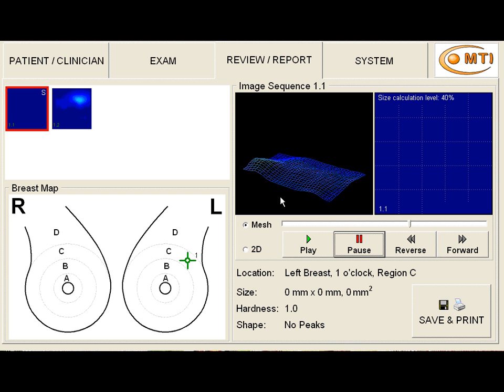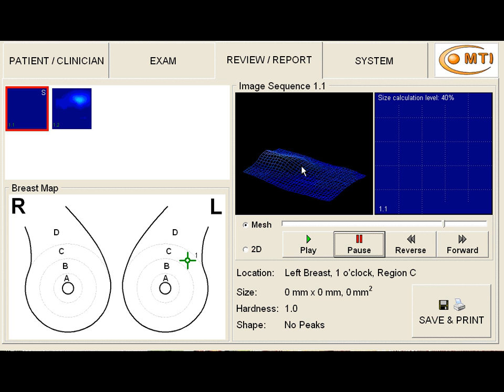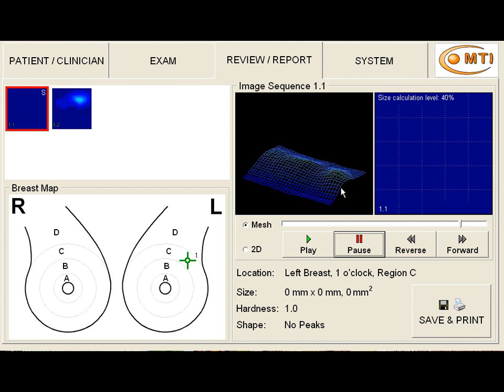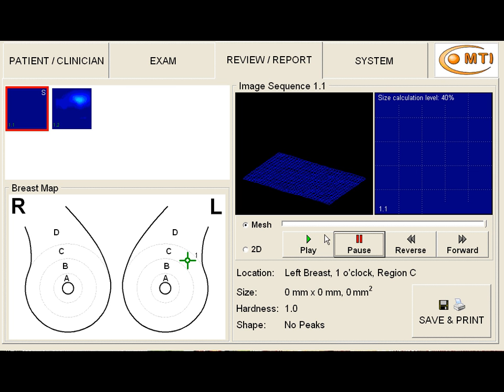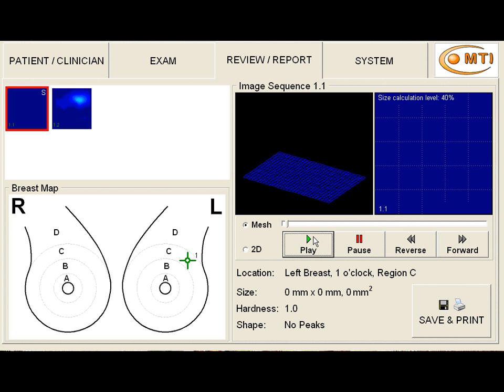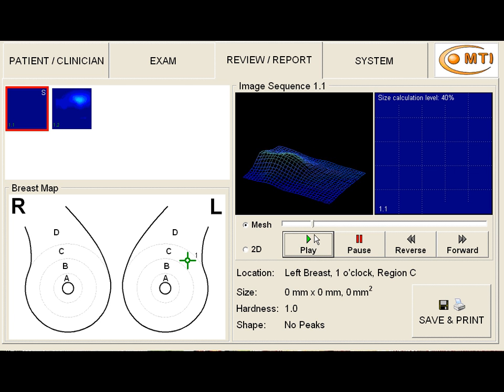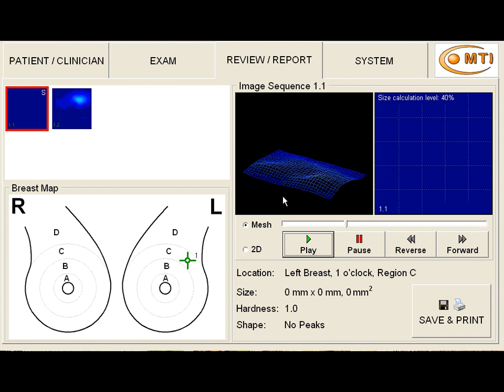Back and forth and back and forth. Those multiple small waves are very consistent with benign fibroglandular breast tissue. This is benign tissue. This is classic benign tissue.